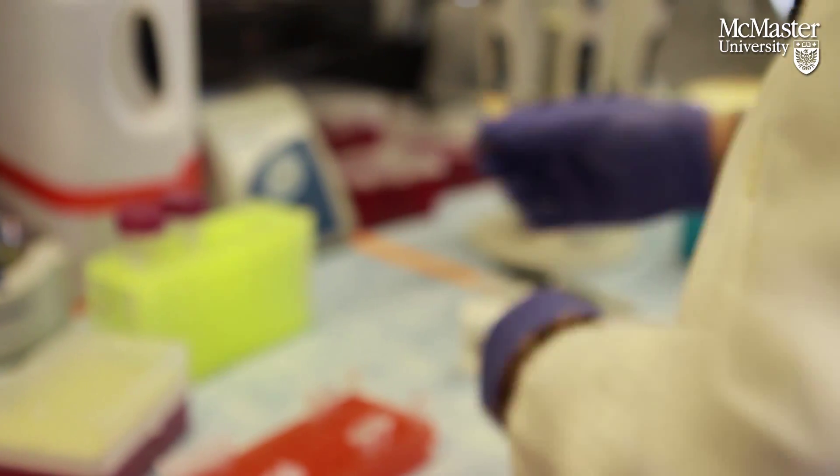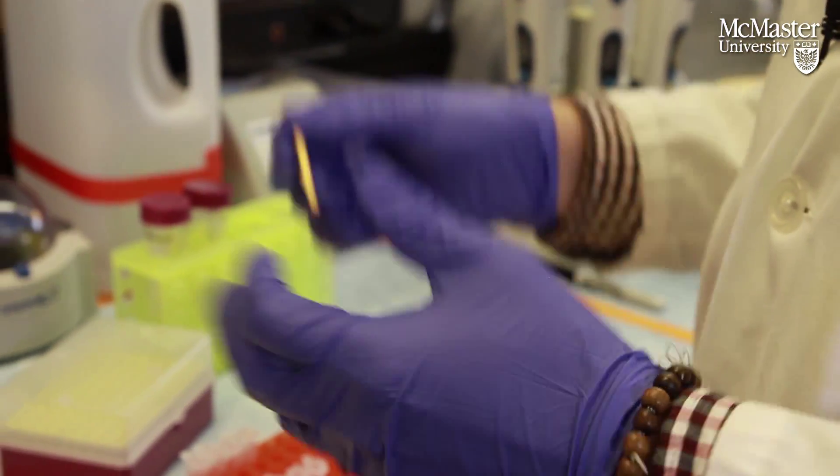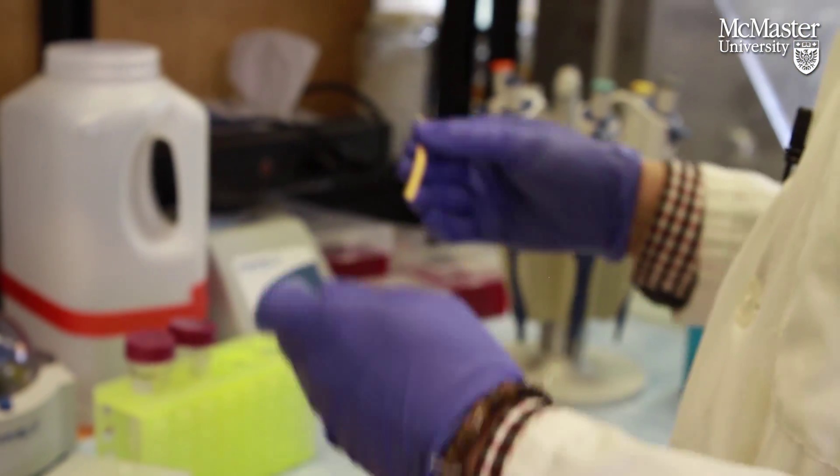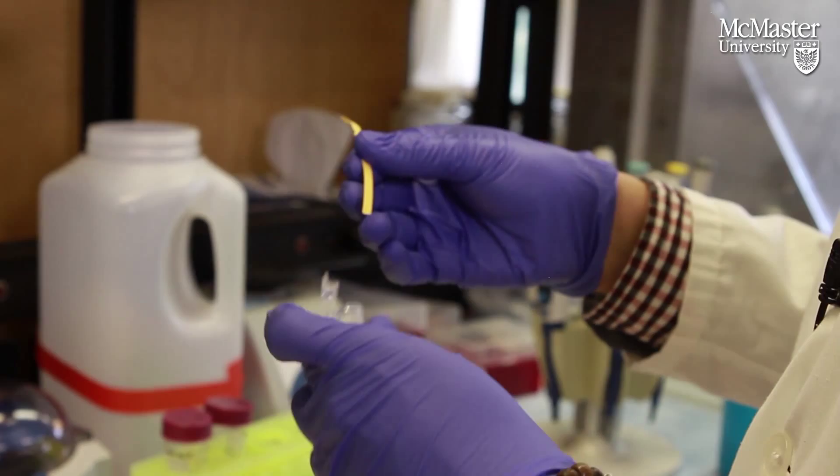This is just standard pH paper that you would use in a high school science lab. It should also turn color.